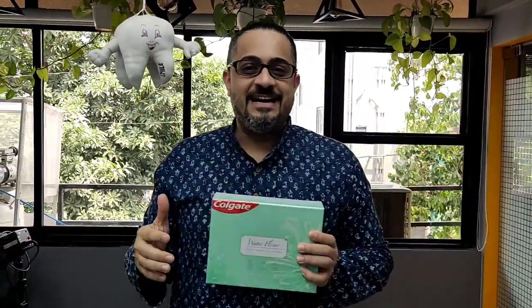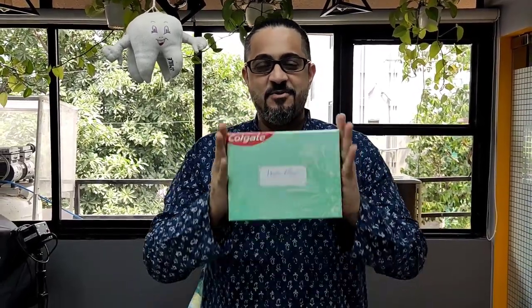Hey guys, Dr. Moise Kakiani, Prosthodontist from Mumbai. In this video I am going to be showing you the unboxing of one of the first Colgate Water Flossers in India.